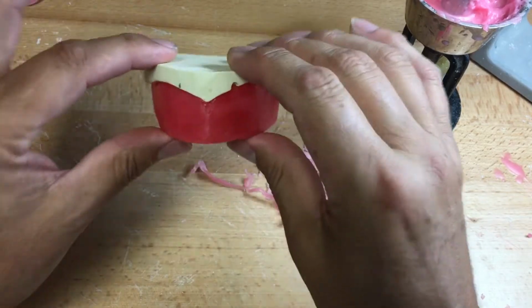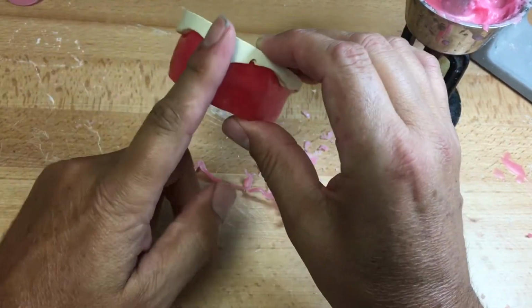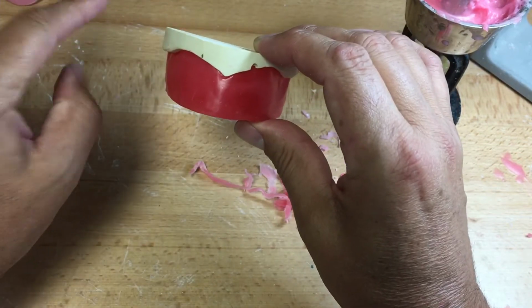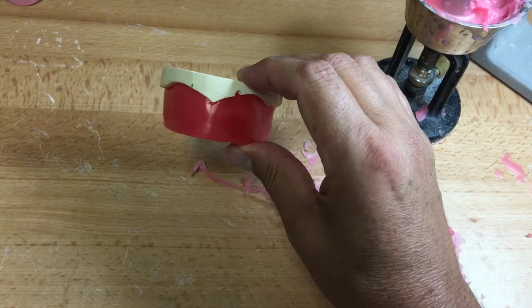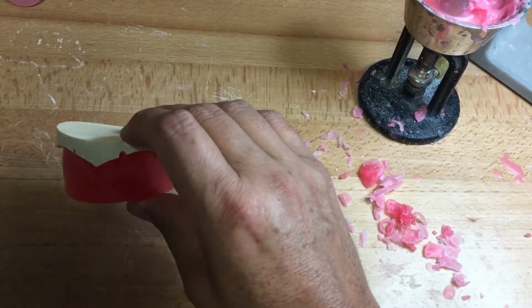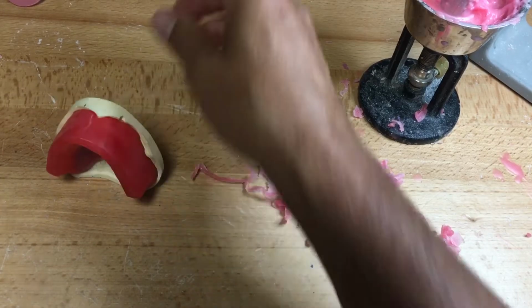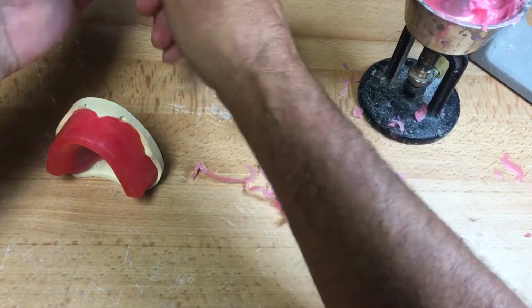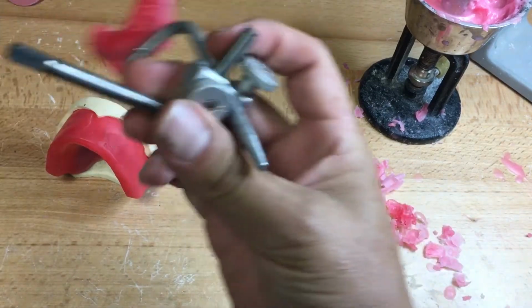So, once the occlusion rim is established for length, contour, midline, canine line, smile line will help us dictate the length of the teeth. The dentist will introduce the facebow record. Facebow record now. Let's get to the facebow record.